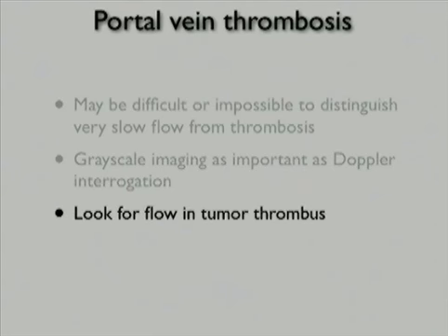It's also important when you see thrombus in the portal venous system to look for flow in tumor thrombus in the setting of hepatocellular carcinoma. And I'll say more about that, how to detect that later.